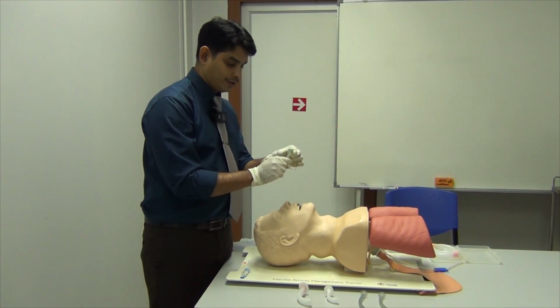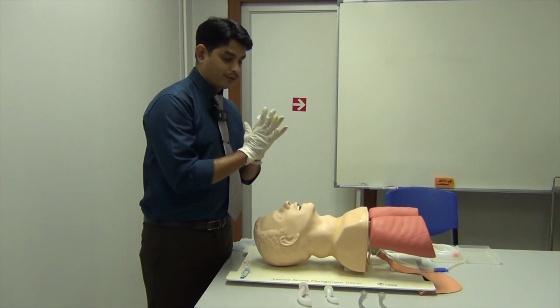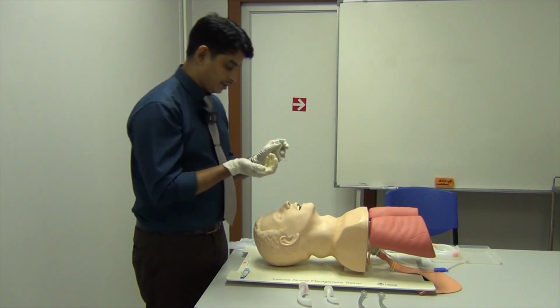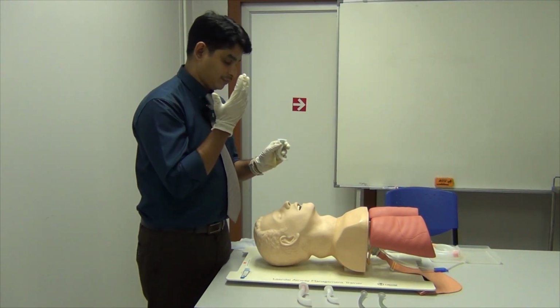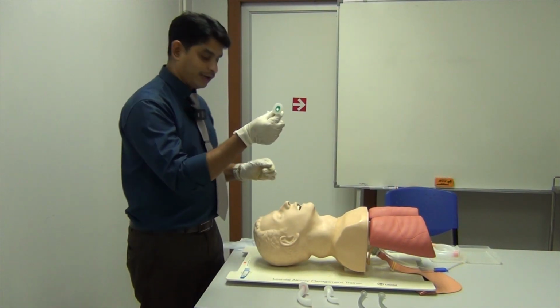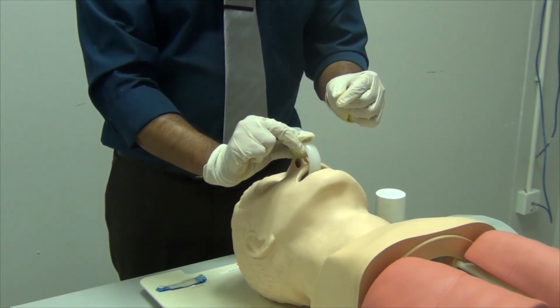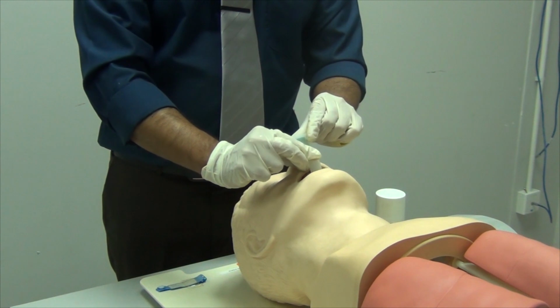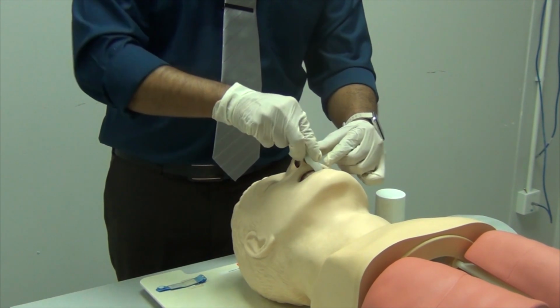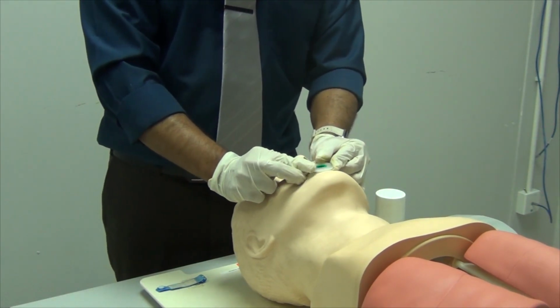How do you introduce it? Find out the right size, wear your protective equipment: the gloves, the face mask, and your face shield. Nowadays it's more required. So introduce the OPA in this fashion. Slide it over the hard palate, and when you feel an obstruction, rotate the OPA by 180 degrees and place it.